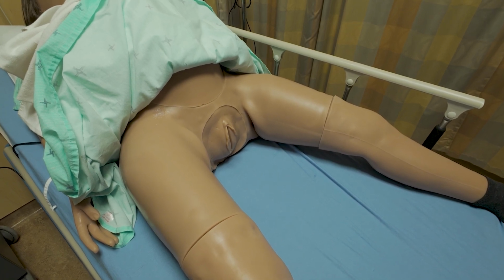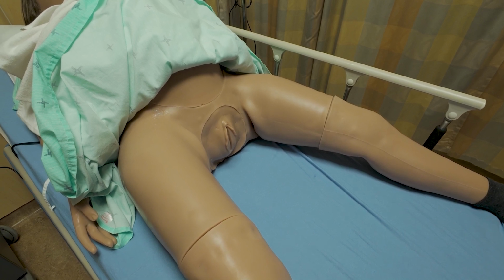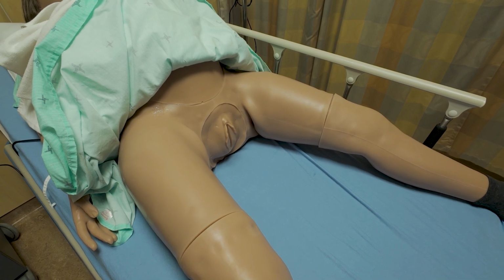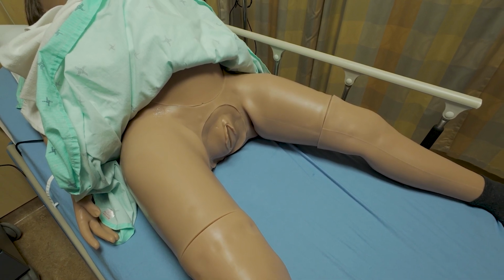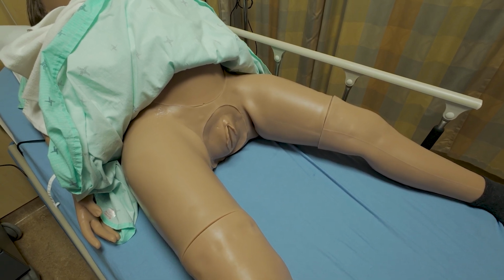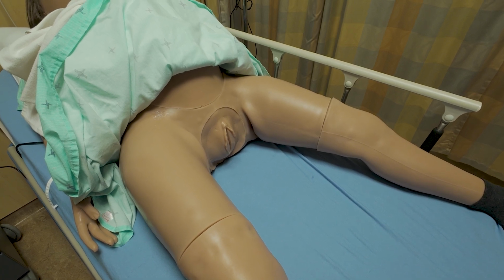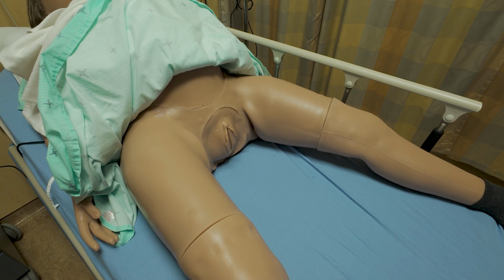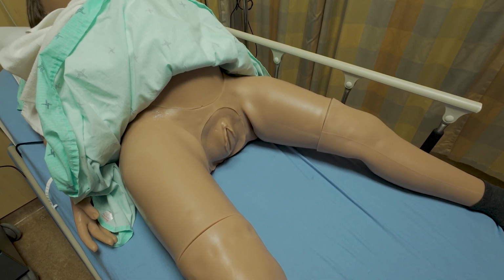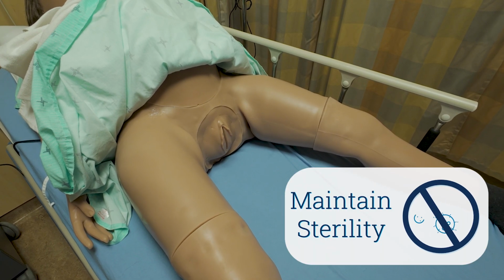A couple of relative contraindications, where you want to proceed with caution, are if your client is group B strep positive, has syphilis or gonorrhea, or has any kind of infection in their urinary tract. The first thing you're going to do is have an informed choice discussion with your client about the reason you're recommending this artificial rupture of membranes. Introduce yourself, if you haven't already, and ensure the client has time to ask questions. Get consent, and wash your hands. This is a sterile procedure that involves a vaginal exam, so it's important to maintain sterility.